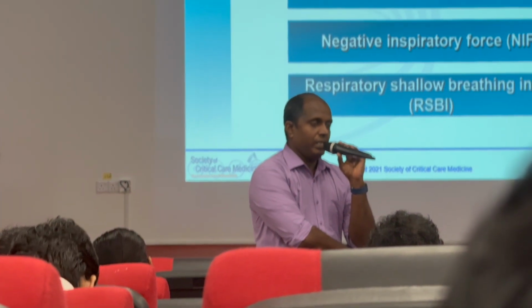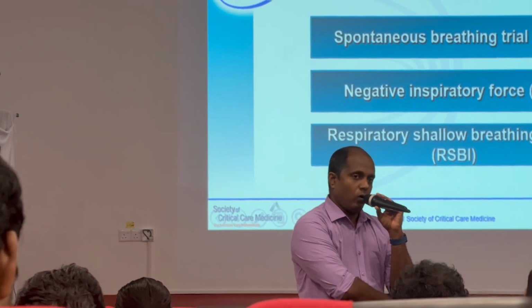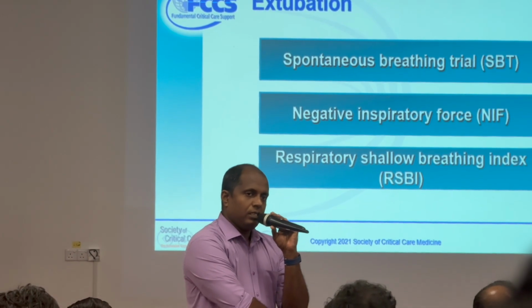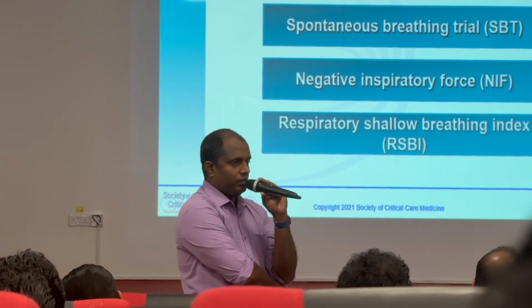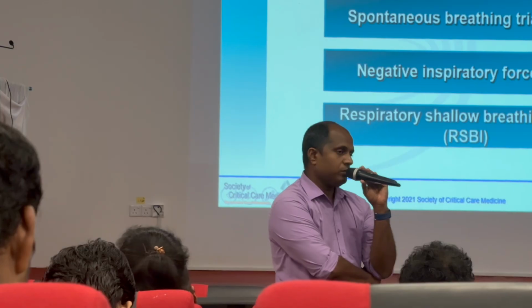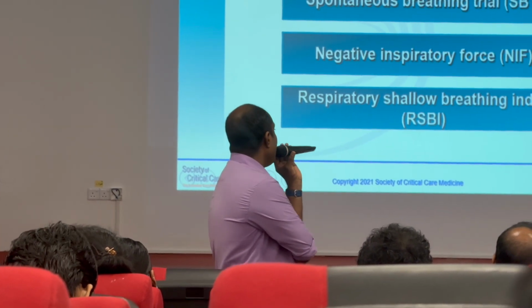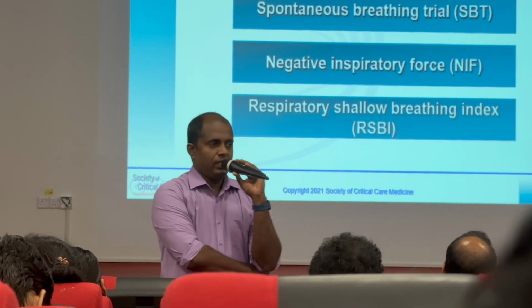So when the patient is ready to breathe on his own, when the support and the demand are met by him on his own, you can extubate the patient. So we see that as a trial of spontaneous breathing. We put on spontaneous breathing with PEEP of 5 and pressure support of 5 for 20 minutes.